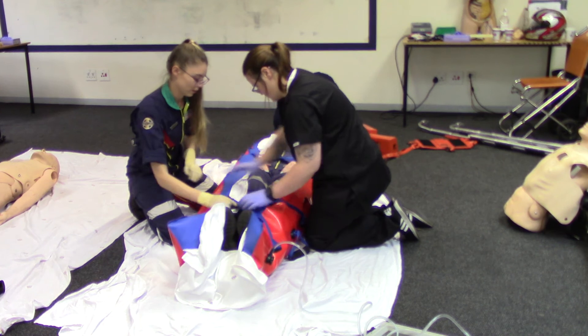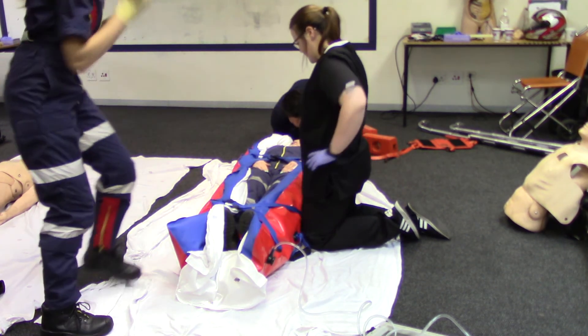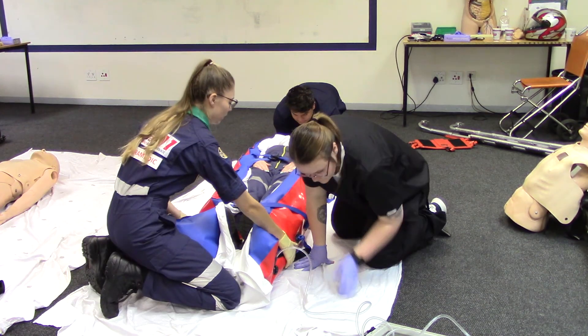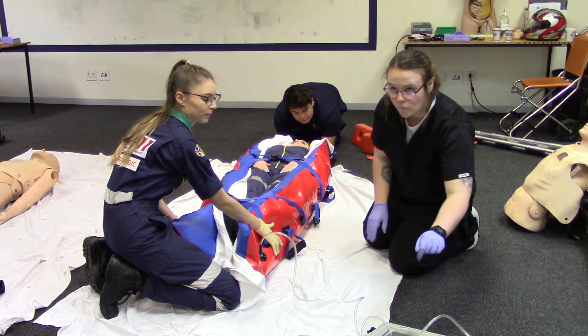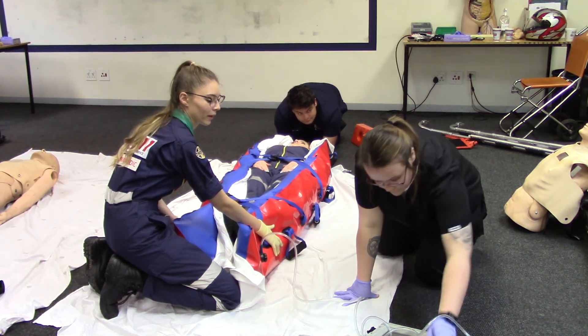Ensure that you have one rescuer at the head and one at the feet, ensuring that the mattress molds firmly to the patient. Extract air from the mattress, causing it to become firm and rigid.